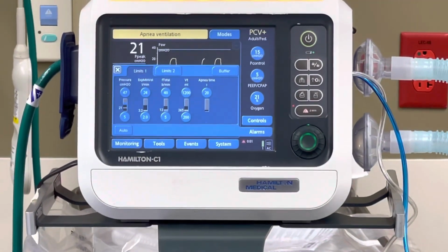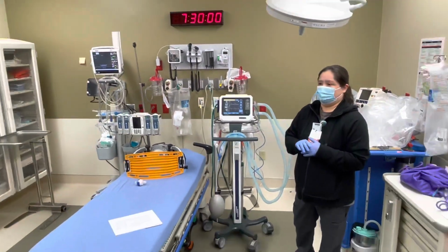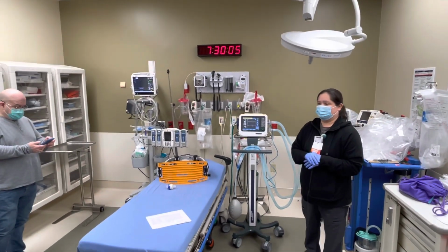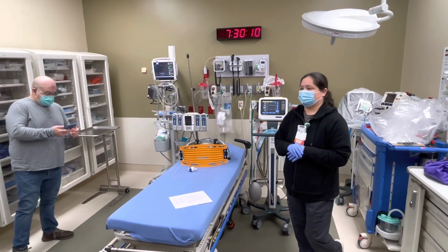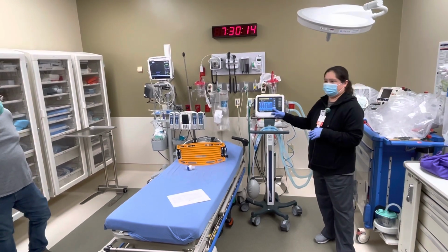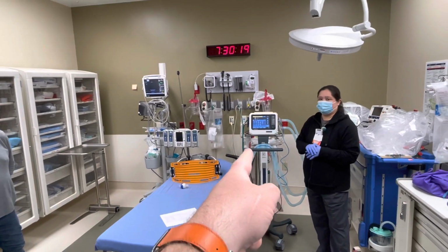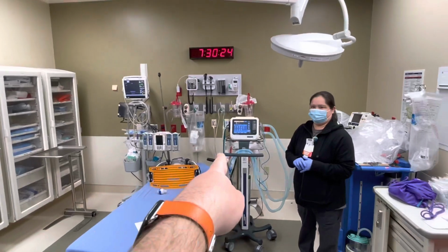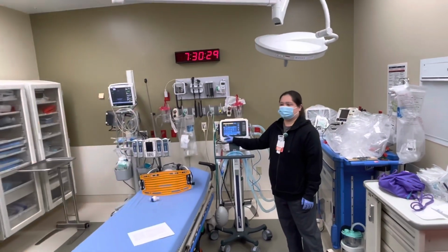Okay, makes sense. So it goes back to the standard setting. Standard, every single time. I think that's what I'm doing wrong, because when mine beeps like that, I think that's the last time we messed with those modes. A lot of times that's where I would go first, is look at my alarms. It'll tell you which one's alarming, across the top, but also in the little area where you'll see the red coming up.